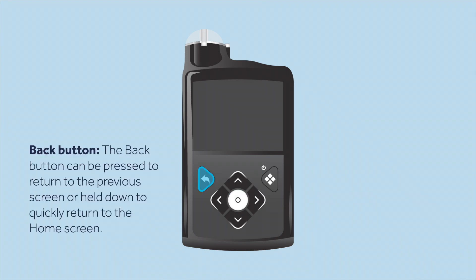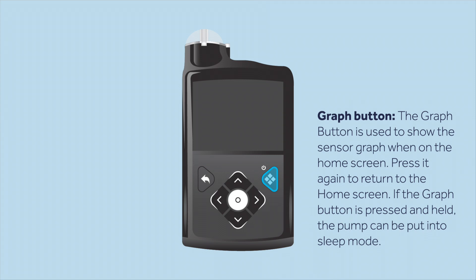The back button goes to the previous screen, or it can be held down to go straight to the home screen. The graph button, when pressed once, shows the sensor graph if you are using continuous glucose monitoring. Press it again to return to the home screen. Press and hold to put the pump into sleep mode.